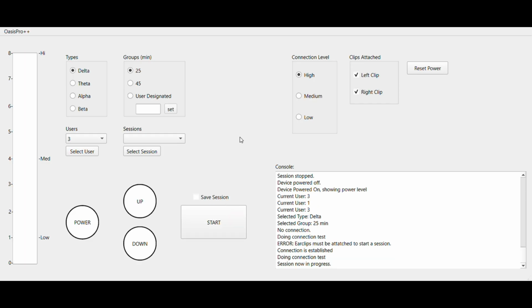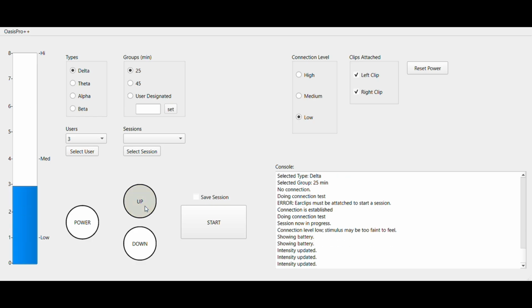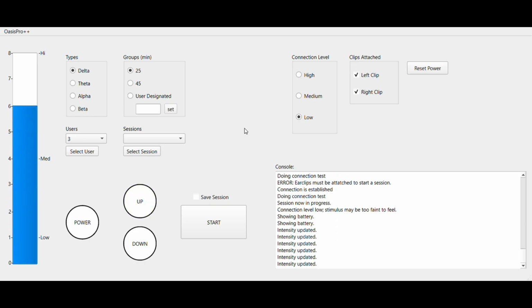Now what happens if you're in a session and the connectivity goes low? Yeah, it warns you. The stimulus may be too faint to feel because the connection level is poor. And so you can see it'll still tick through, not draining the battery though because we have the intensity set at 0.